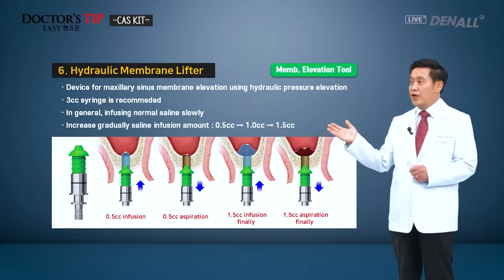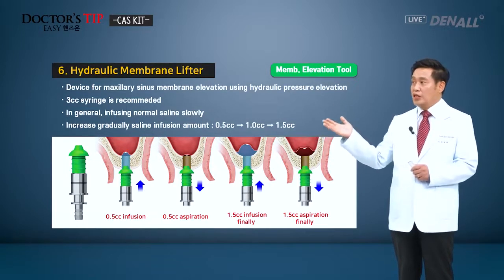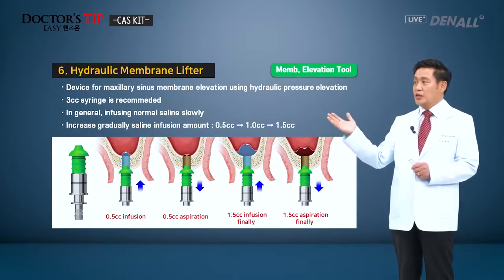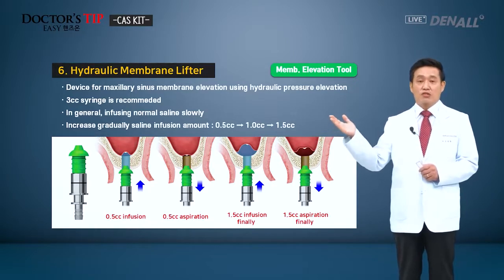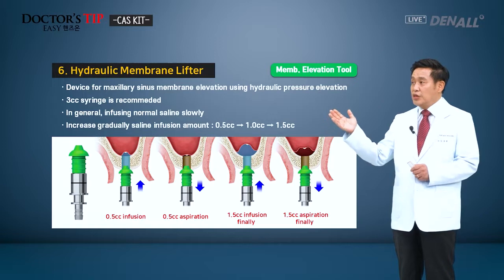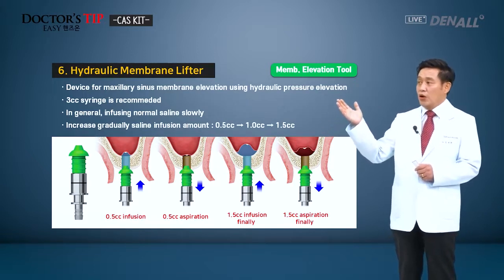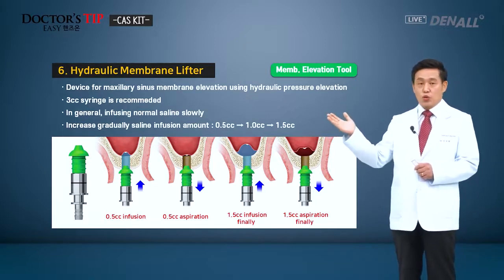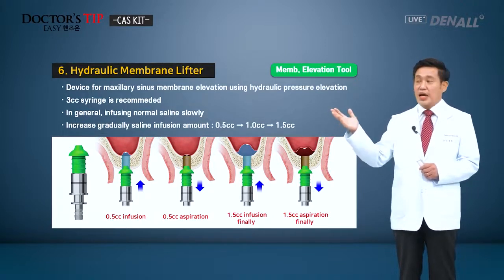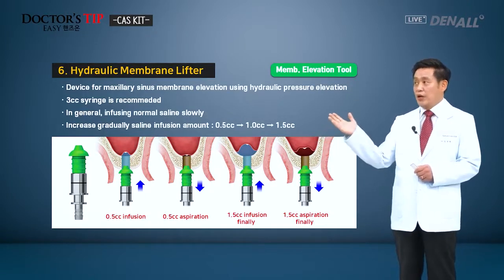Next, hydraulic membrane lifter. Simply put, after penetrating into the sinus floor, the sinus membrane can be safely lifted hydraulically. For this hydraulic membrane lifter, a 3 cc syringe is recommended. The pressure is not high. The sinus membrane damage is minimized when lifting.